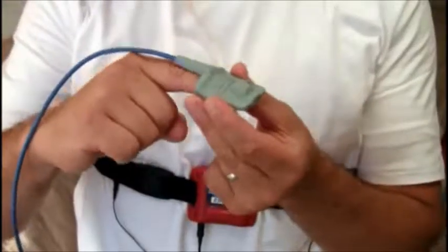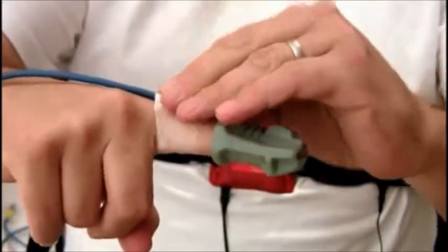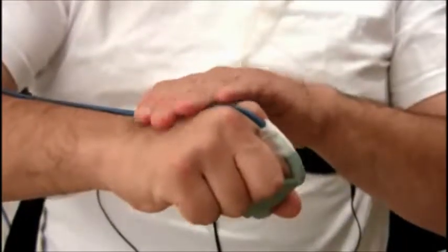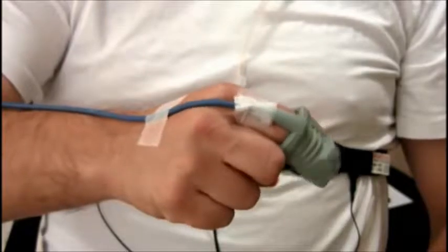You can now insert your finger into the finger sensor, making sure your finger is pushed all the way to the end of the sensor. Apply tape to secure the sensor cable to your finger. Next, make a fist and apply the tape on the sensor cable to the back of your hand, then release your fist.